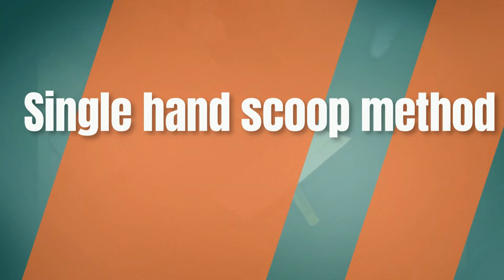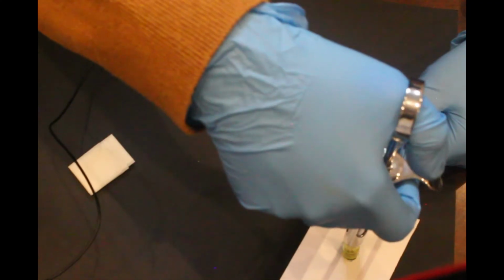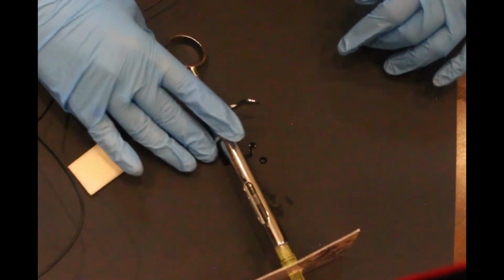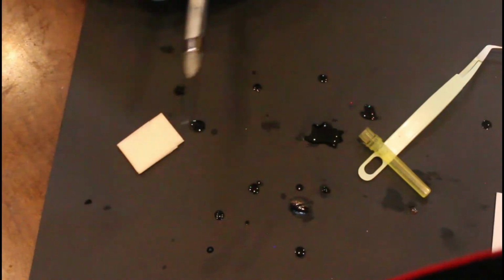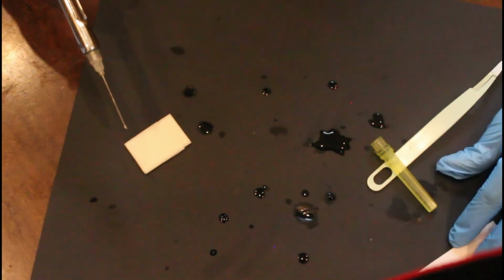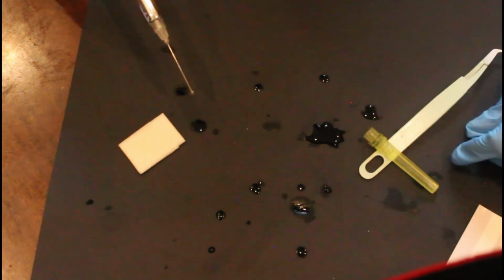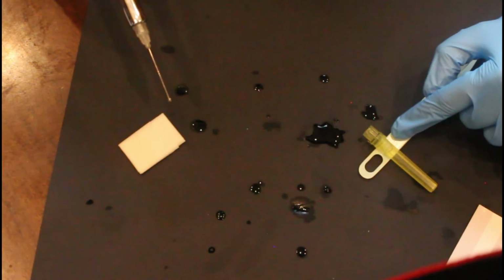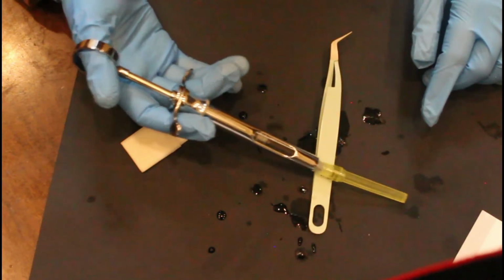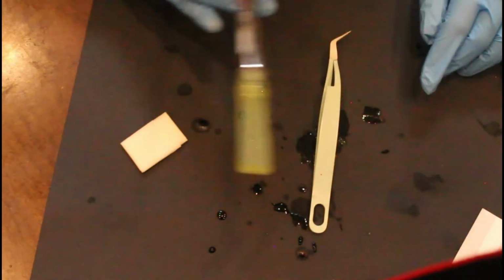All you have to do is insert the needle, hold it vertically towards the counter surface to leverage and push it into the needle cap. If you do not have the protector sheet, you want to place the needle cap over a slanted surface so that it's off the countertop, and you use a single hand scoop technique. Insert the needle, then again use the counter surface as leverage to push the needle cap back in.